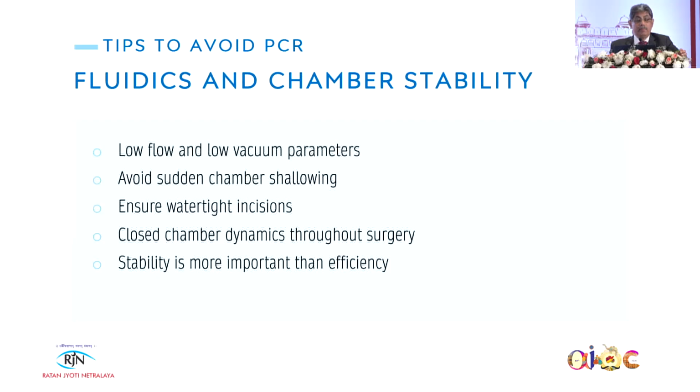Now, we should keep low flow, low vacuum parameters and avoid sudden chamber shallowing. So always fill the chamber with the viscoelastic before you remove the irrigation handpiece, and ensure watertight incisions that should match with your instrument, the side port incision. Closed chamber dynamics throughout the surgery.